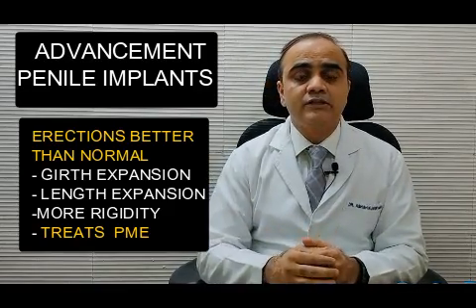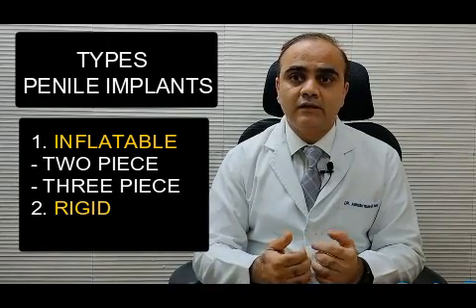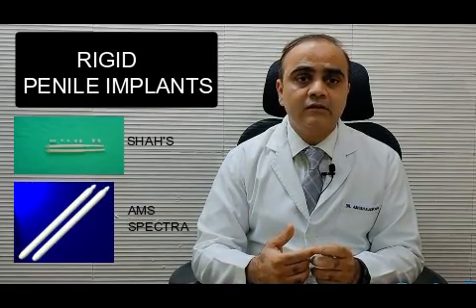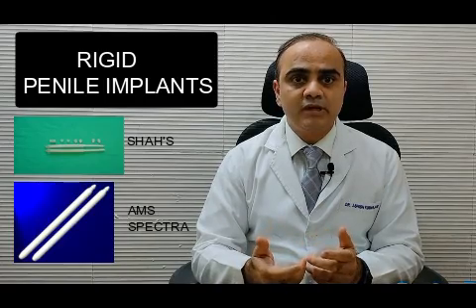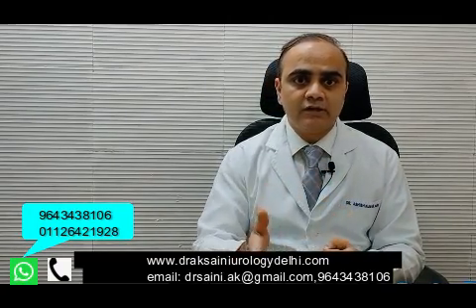Now coming over to the rigid implants, the rigid implants are imported as well as Indian made. The Indian made ones are very cheap, and the imported ones are obviously costly. They will give you an erection which is rigid enough, but then they are not concealable. You will always have a rigid penis, so you have to actually bend your penis up when you are putting on an underwear, and therefore that's the only problem with the rigid implant.